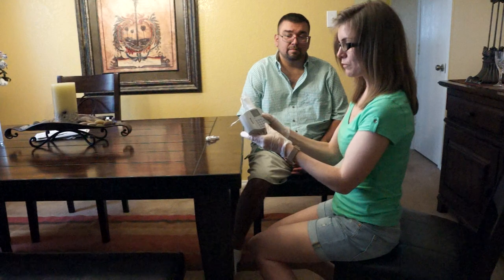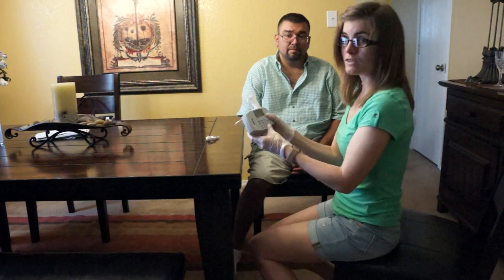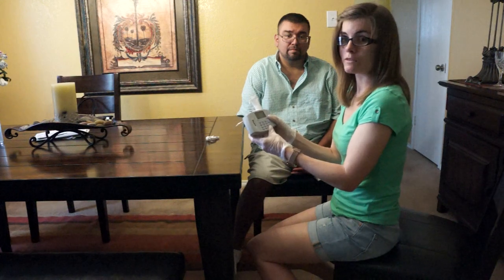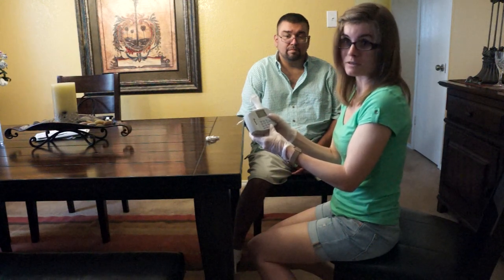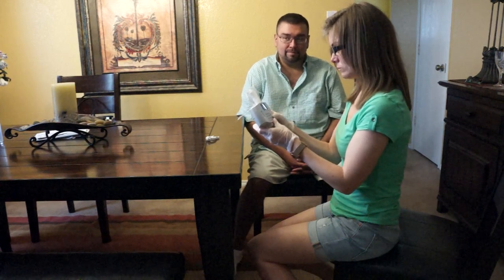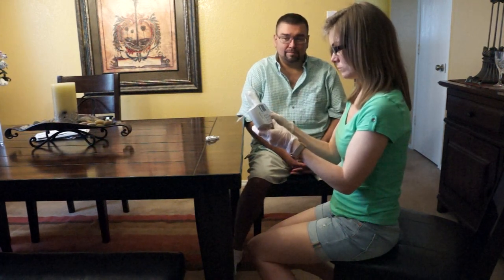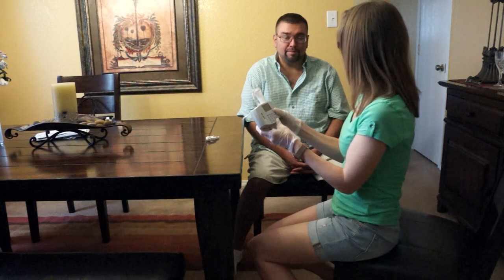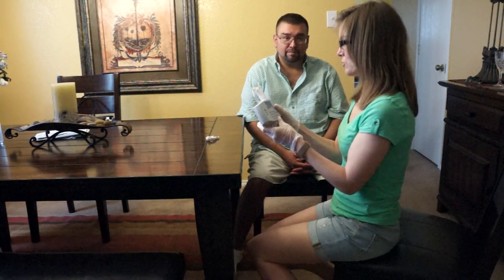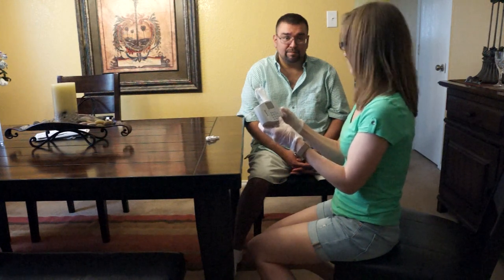Okay, then it's going to ask me for ethnicity. And that's also an important factor. You need to know that because with every ethnicity, the outcomes are different. Do you smoke? No. Have you smoked previously? No. And do you have any history of asthma? No.